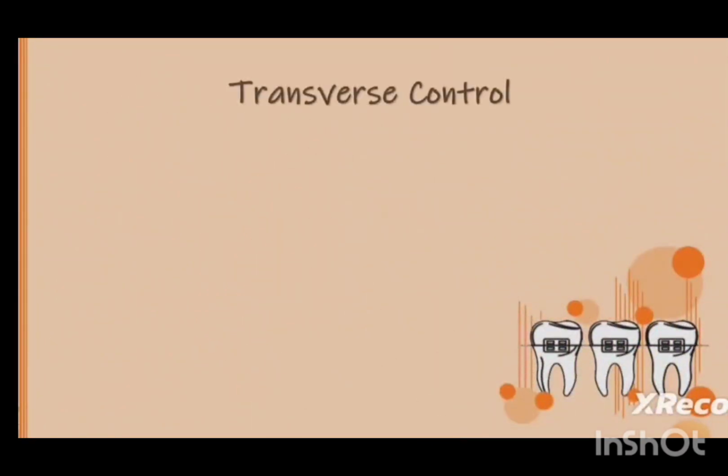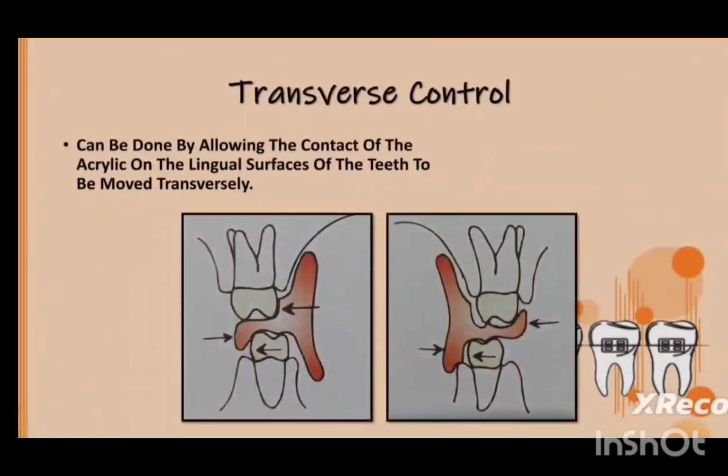Now coming to the transverse control, it can be done by allowing the contact of the acrylic on lingual surfaces of teeth to be moved transversely, as you can see in this image. This will cause the transverse control.